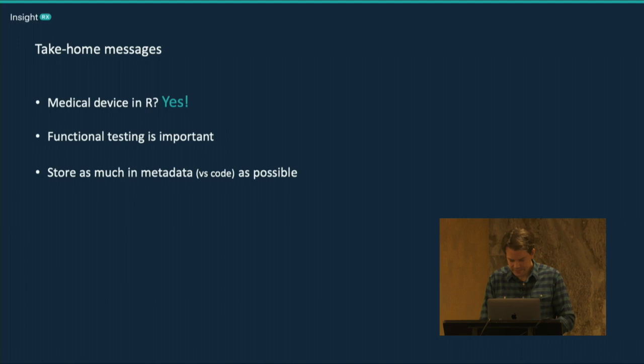And then the last thing that I briefly mentioned is that, in my opinion, it really helped us that, at least for the crucial code of our medical device, we wrote it ourselves, so we know exactly what's going on under the hood. Well, thank you for your attention, and I'd be happy to take some questions.